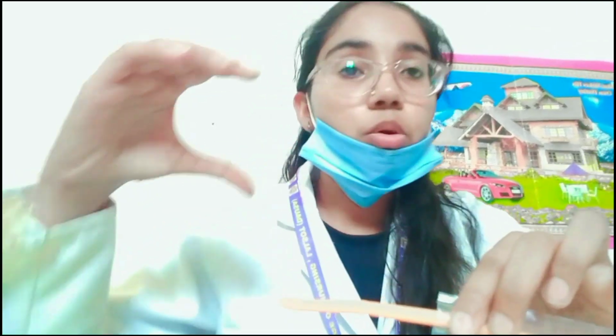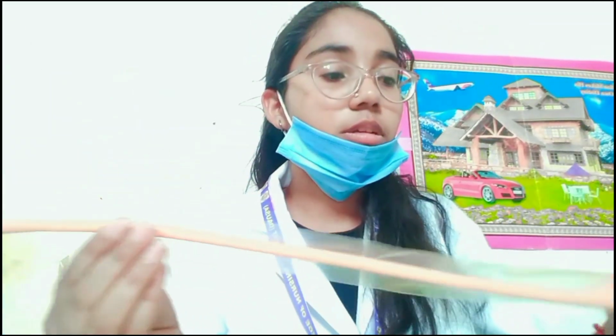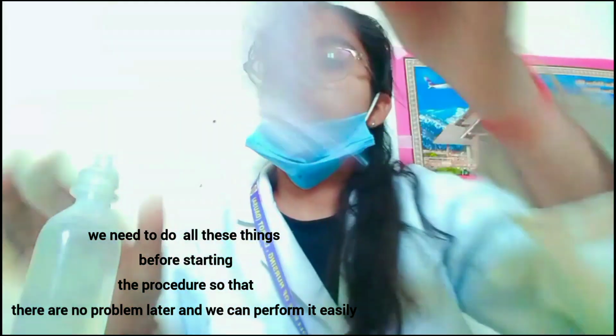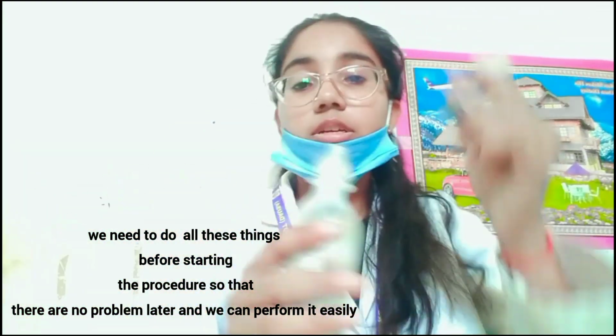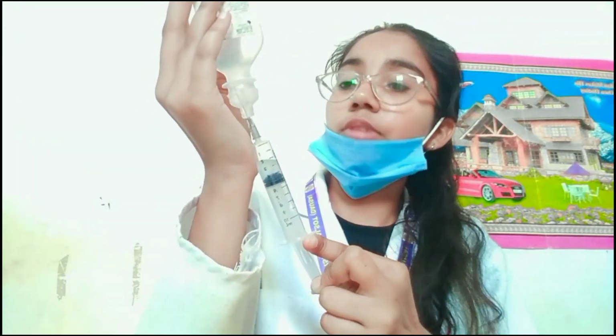So with the non-dominating hand, spread the labia majora and minora to expose the urinary meatus and insert the tip of the catheter into the urethra. And now you see the flow of urine from the urine drainage pot. Okay. Then hold the catheter in place and take a syringe with distilled water filled in a 10 cc syringe to inflate the balloon, which helps to secure the catheter in place within the bladder.